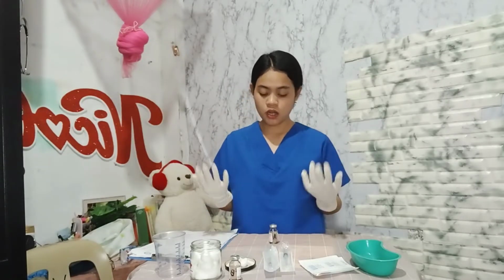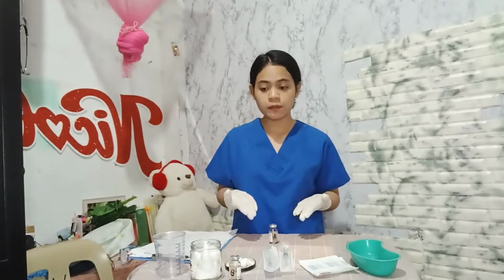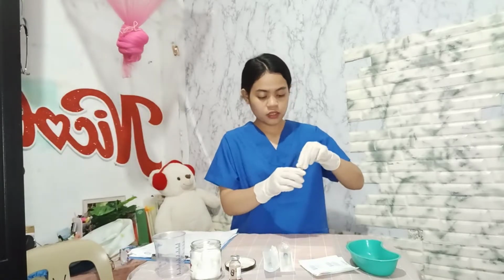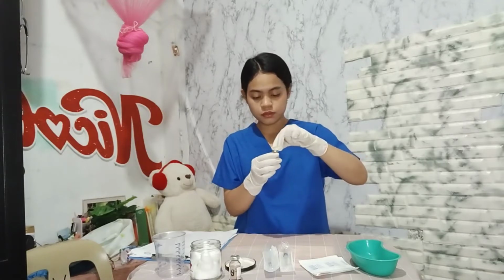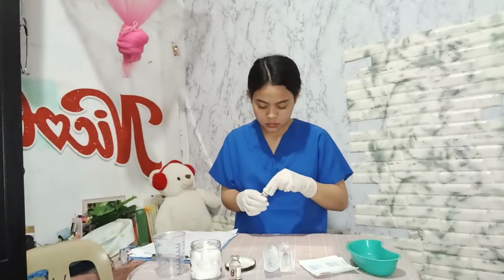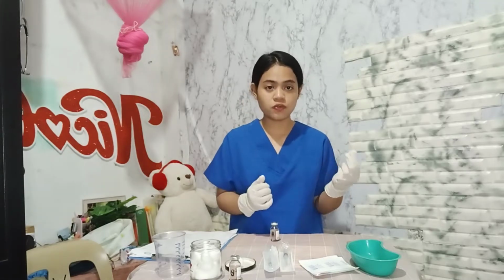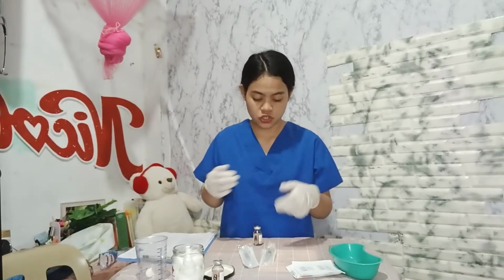Then remove the protective cap or clean the rubber cap with an antiseptic wipe by rubbing it in a circular motion, and discard it to the sharps disposal. Then next, withdraw the medication. Attach the filter needle to the syringe.